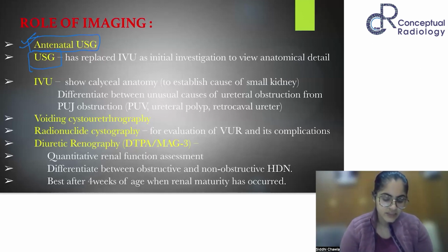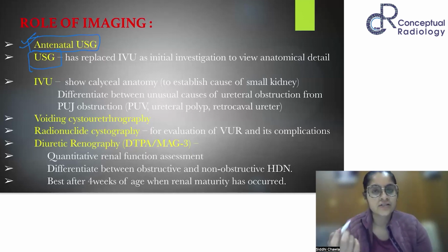Then ultrasound, as a general practice, is mostly the first modality of choice in children with any suspected renal pathology. If the patient has deranged KFT or any urinary problem, the ultrasound KUB is what is usually advised. And I would always suggest that whenever you do an ultrasound KUB, kindly include the genitourinary system in your examination. At least see the prostate and the seminal vesicles in males, and the uterus, ovaries, cervical canal and vagina in females, because the anomalies in both systems are associated.